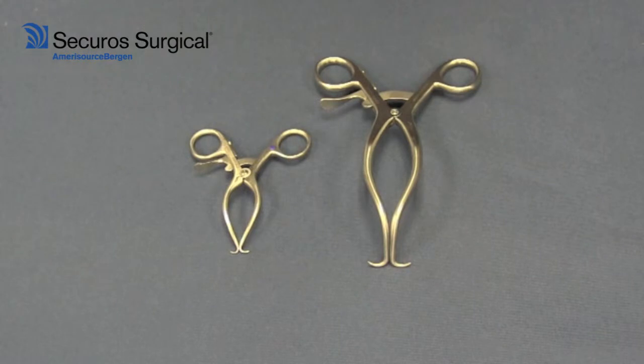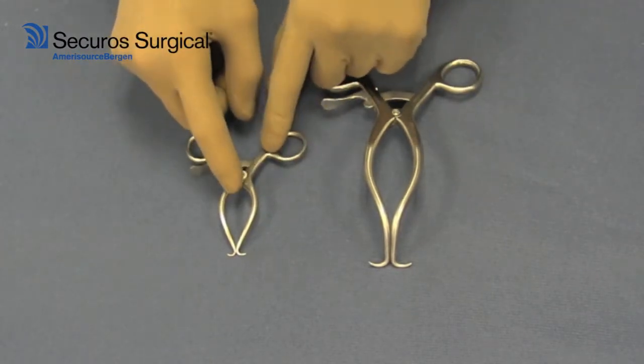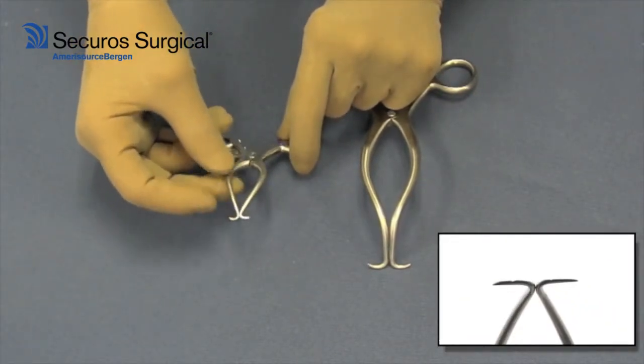I would suggest that one of the most valuable instruments you might have in your surgery pack is a galpy retractor. As you can see, the galpies have the limbs that are arced, and at the end of each limb is an outward pointed barb point, sharp point, so as to grab the soft tissue for retraction.